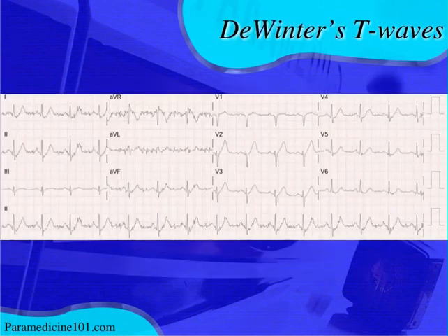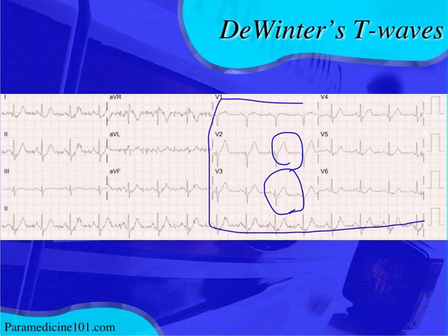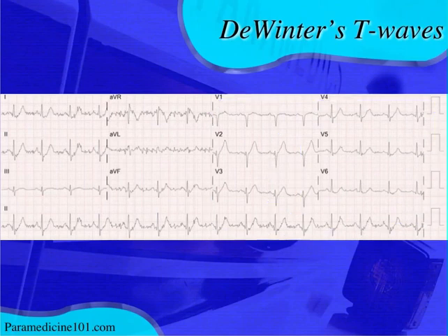Here's an example of De Winter's T waves. De Winter's appear hyper-acute — broad-based, tall, and symmetrical — but you also have J-point depression alongside these tall symmetrical T waves. J-point depression here is an early indication of an impending myocardial infarction; in fact, the infarct may have already started. You need to keep monitoring this patient and take them to a PCI facility.